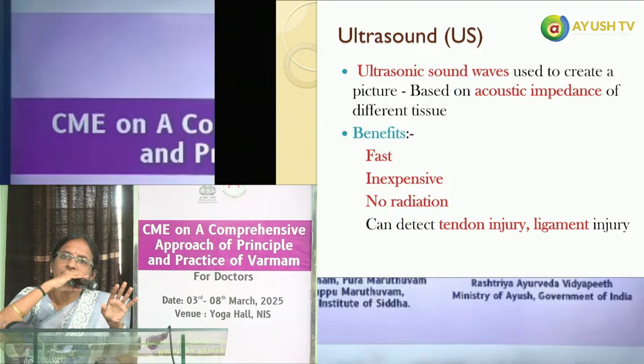So இதோட advantages வந்து it can be done very fast, plus everywhere it is available. Cost is very less compared to the other investigation modalities. And கண்டிப்பா இது வந்து அல்ட்ராசவுண்ட் வேவ்ஸ்ங்கிறதுனால இதுல ரேடியேஷன் ப்ராப்ளம் எதுவும் கிடையாது. அண்ட் இதோட அட்வான்டேஜஸ் டெண்டன்ஸ், லிகமெண்ட்ஸ் இதுல ஏதாவது இன்ஜுரி இருக்கான்னு பிக் பண்ணலாம். பட் ஸ்டில் இது எல்லா அல்ட்ராசவுண்ட் மெஷின்ஸ்லயும் இந்த அளவுக்கு கிடைக்காது. It requires special probes, pencil probes, high frequency probes, அந்த மாதிரி இருக்கிற செட்டப்ல மட்டும் maybe டெண்டன், லிகமெண்ட்ஸ் இதோட கண்டினியூட்டி எல்லாம் நம்மளால அல்ட்ராசவுண்ட்ல நல்லா ட்ரேஸ் பண்ண முடியும்.